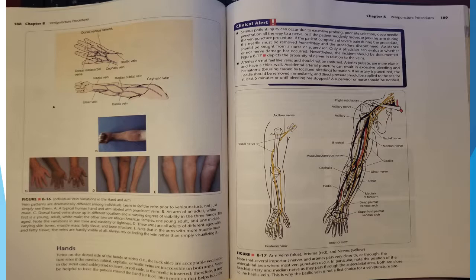Clinical alert. Serious patient injury can occur due to excessive probing, poor site selection, deep needle penetration all the way to the nerve, or if the patient suddenly moves or jerks his arm during the venipuncture procedure. If the patient complains of severe pain during the procedure, the needle must be removed immediately and the procedure discontinued. Assistance should be sought from a nurse or supervisor. Only a physician can evaluate whether or not nerve damage has occurred. Nevertheless, the incident should be documented.